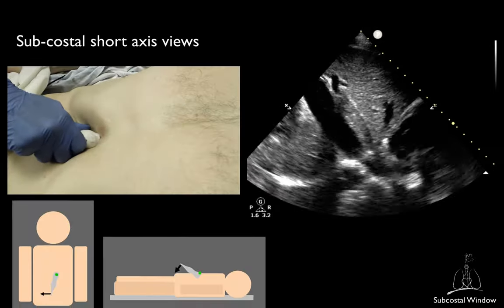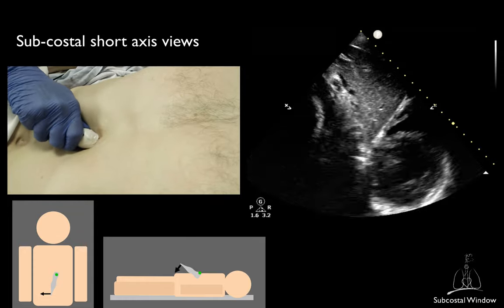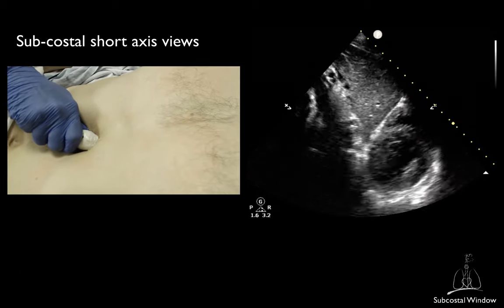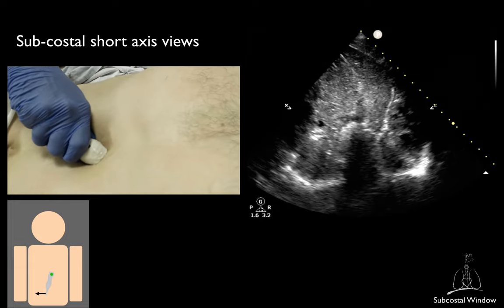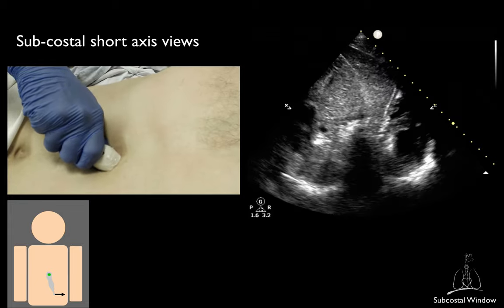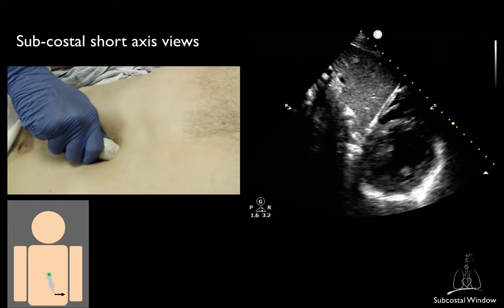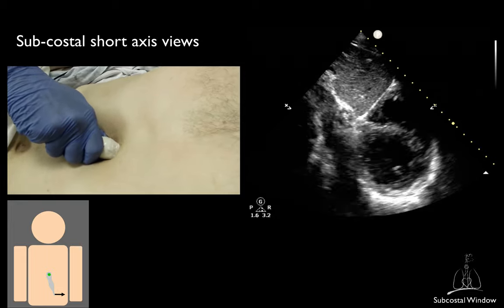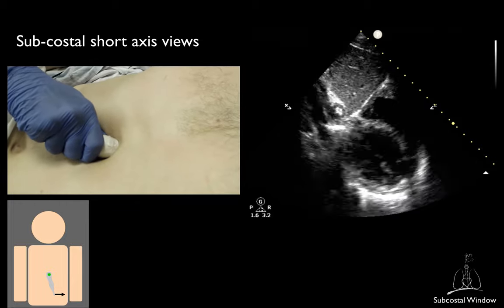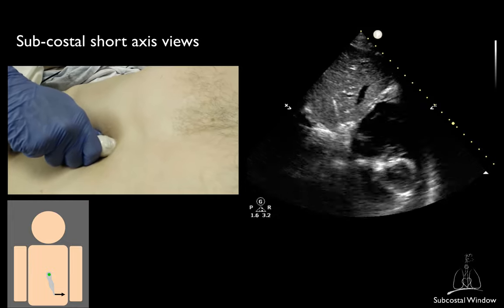By tilting the footprint towards the patient's left and rocking cephalad, you should be able to obtain the short axis of the left ventricle. By tilting the footprint even more to the patient's left, you will see the short axis at the apex level. If you then tilt the footprint towards the patient's right, you will get the short axis at the mid-papillary level, then the mitral valve level, and finally the right ventricular inflow-outflow.